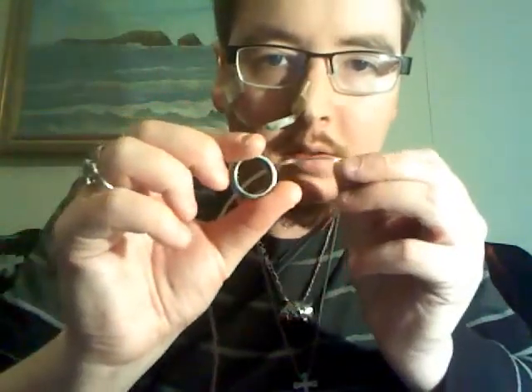Here, I'll show you. This is my wedding ring. This is the tube. So it's not very big, so if any of you are worried about it being very big and uncomfortable, it's not too uncomfortable, I guess. I have a deviated septum because I had my nose broken one time by my brother, and I never really got it fixed. So I just feel a lot of pressure if I turn a certain way. But other than that, it was no problem going down. She had to measure it to a certain level of where it had to be in my body.